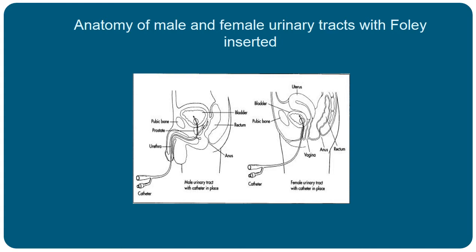Never inflate a Foley balloon without seeing urine first. If you do not get urine, press gently on the bladder. If still no urine is present, consult a urologist. This is a doctor who specializes in urinary incontinence and also in problems with the bladder and kidneys.